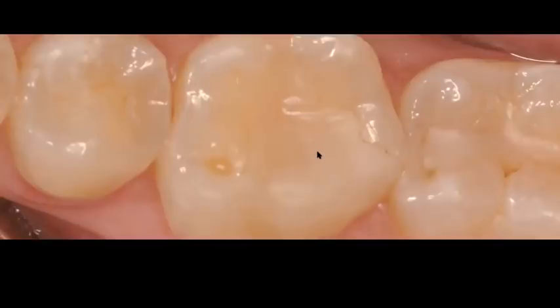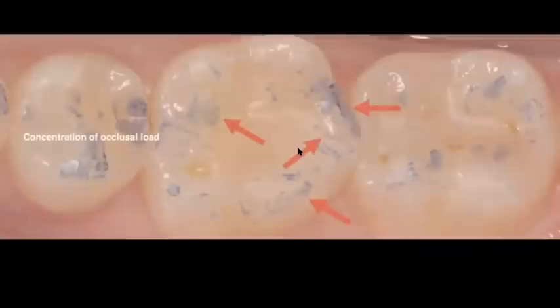Because I want to make sure that my composite and the tooth structure both interact correctly and have occlusal contacts. I want to try to stay away as much as I can from the margins of my restoration. I don't want any occlusal contacts on the margins of the tooth, or the interface between the restoration and the tooth, because those are weak areas of my restoration. And if I maintain contacts there, most likely you're going to get chipping and fracturing of your restoration fairly soon.